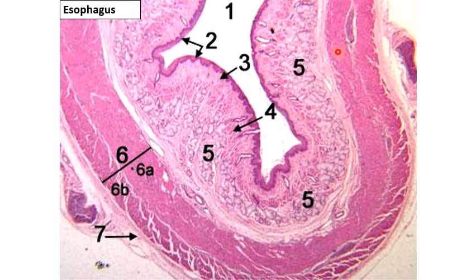Here, dear students, it is a large round structure with a lumen. Look at the epithelium, non-keratinized stratified squamous epithelium, so it is esophagus. Dog or cat? Look between the epithelium and the muscle layer. It is esophagus, dog. Number 1 is the lumen. Number 2 is the epithelium, non-keratinized stratified squamous epithelium. Number 3 is the lamina propria under the epithelium. Number 4 is the muscularis mucosa.